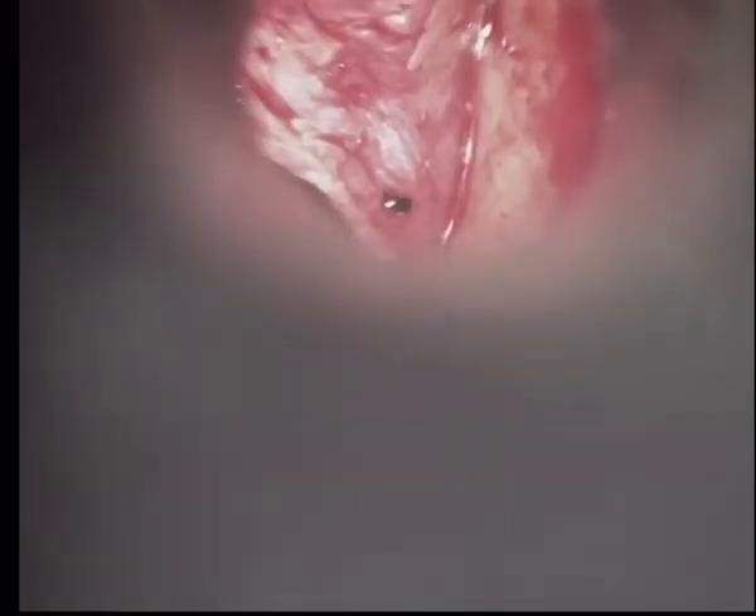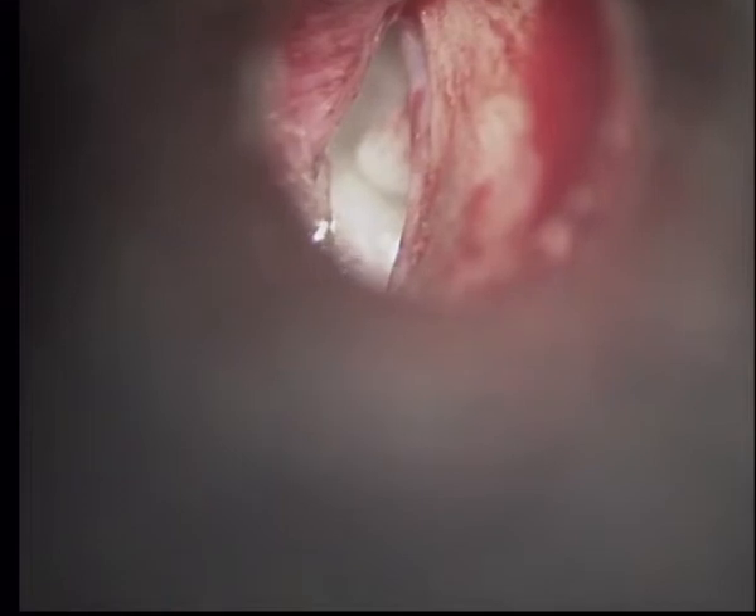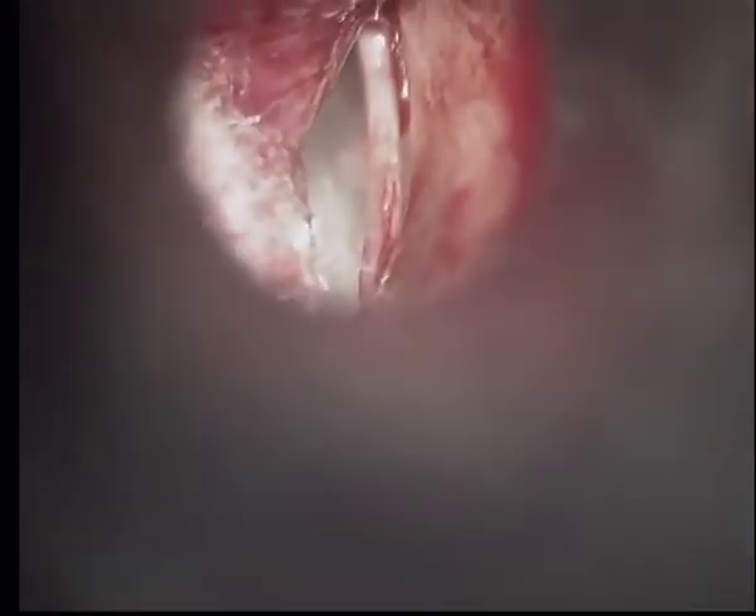The TM flap was elevated from 6 o'clock to 12 o'clock. Here we can see after elevating the TM flap, the annulus and chorda tympani can be seen. The flap was elevated and the middle ear was entered. Here we can see the chorda tympani, incus, and stapes.